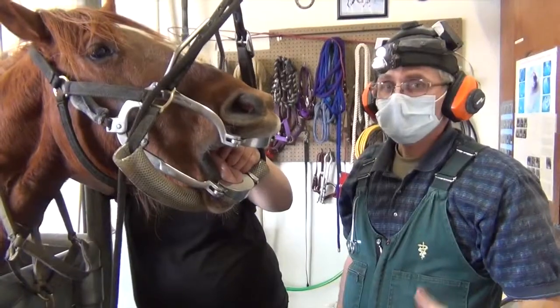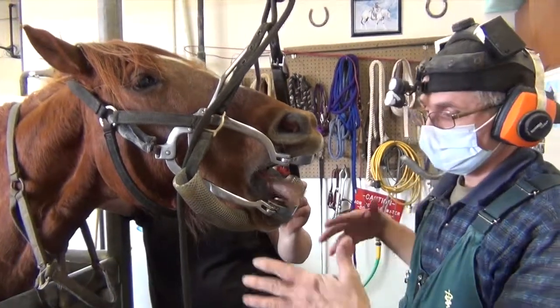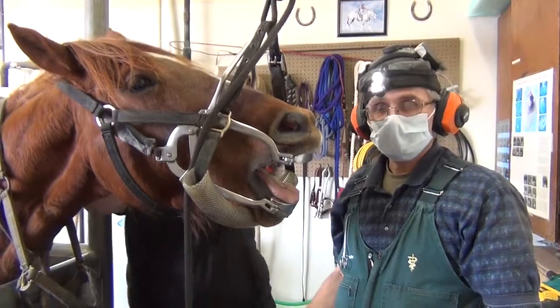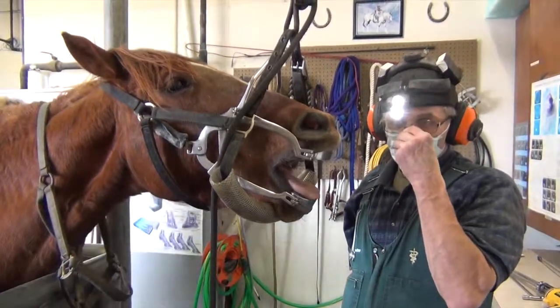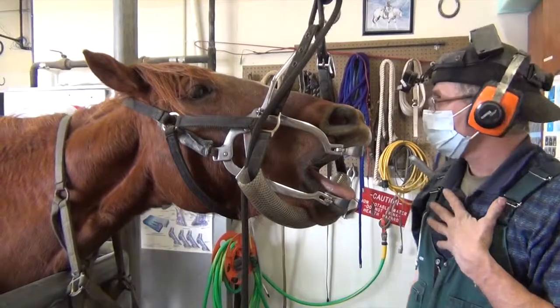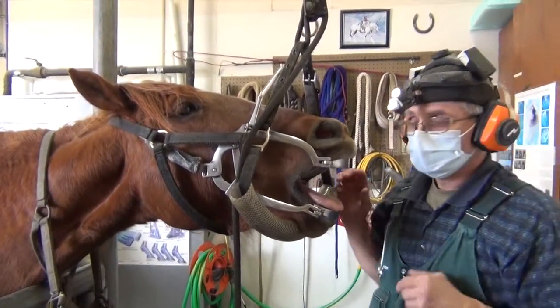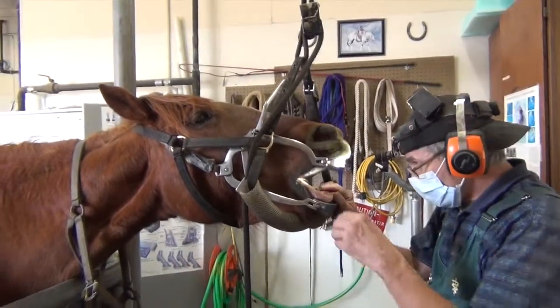Okay. One of our concerns is our own health. So that starts with the containment and proper sedation of the horse so that everything's safer, but it's also the things that we wear. So we wear the mask so that we're not inhaling all of that fine dust, which if you're doing a lot of this, it's going to get down into your lungs and cause problems. And then of course the ear protection for protecting our ears, because the grinder's pretty loud.